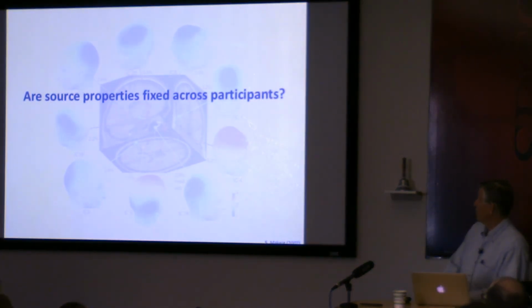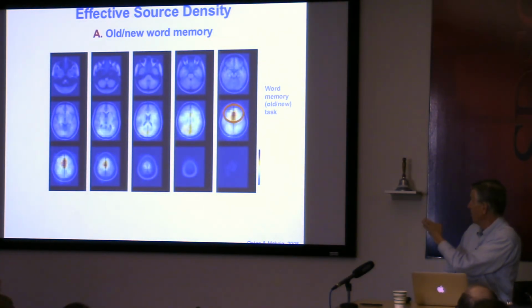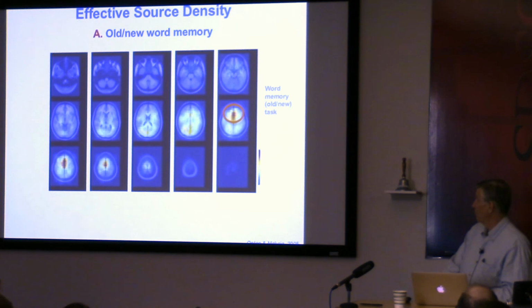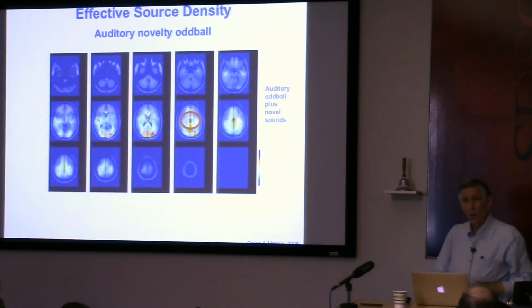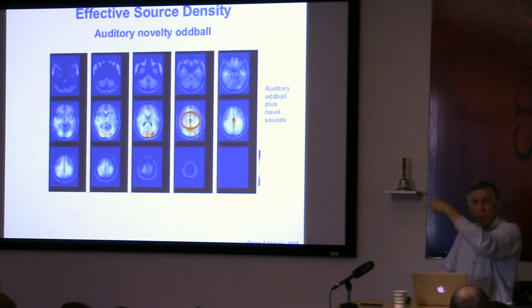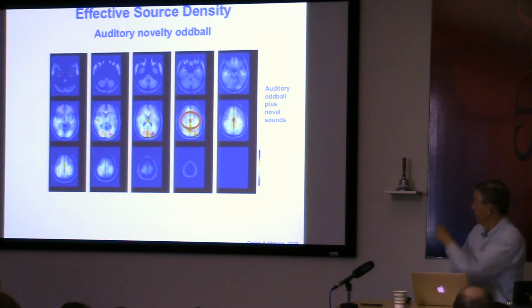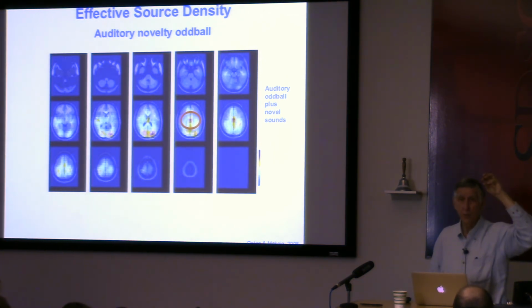Are they fixed across participants? Well, we saw that. The co-registration here is rather simple, of each subject's electrode positions to the head. So it's not extremely accurate. And yet the size of these dots shows that this is the level at which we can attain replication across subjects. The size of those dots is about the extent of the blur that we gave to each dipole position.